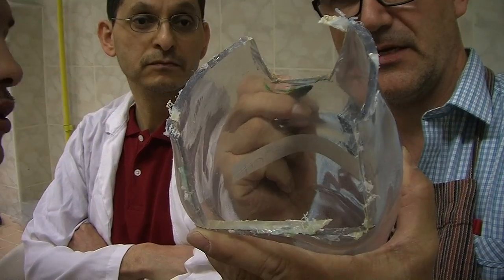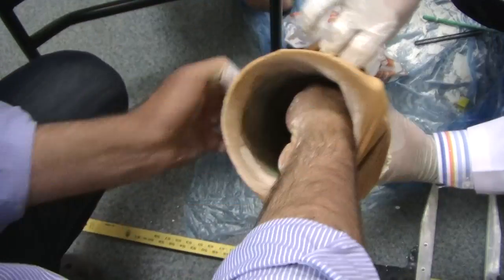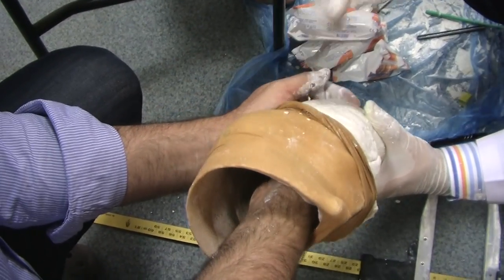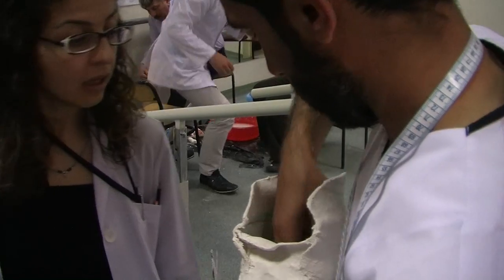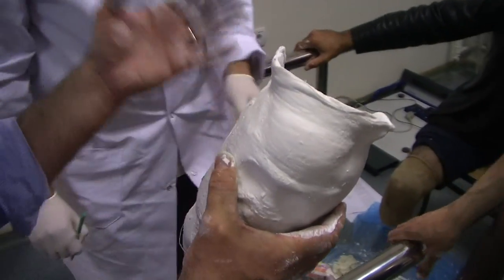The point for now is to keep as much as possible inside the structure — everything is very clear there. Well done. Just press this; it's a bit thin here, you need to be careful. Your modeling is fast, just like this — very fast. You made a very good result. I can see that you understand what you're doing, but I think it would be very good to go through the procedure one more time together with Nikos.